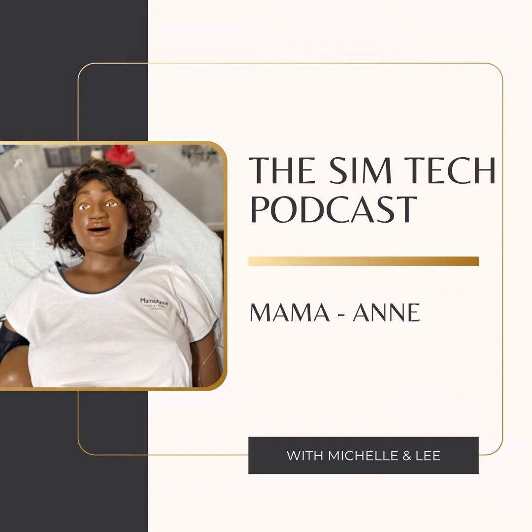You can do CPR on her. Obviously, as with most simulators, just make sure that she is treated as we would treat a real person. We're not going to start jumping up and down on her chest when she's breathing and talking to us and blinking away. So if you do any CPR on her, make sure that she is in some sort of cardiac arrest, or you put the respirations to 0.